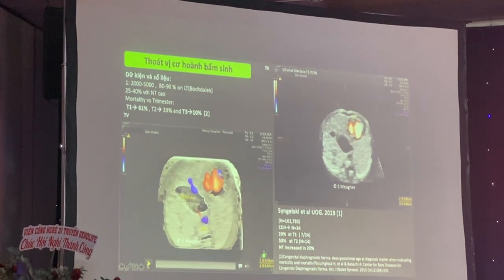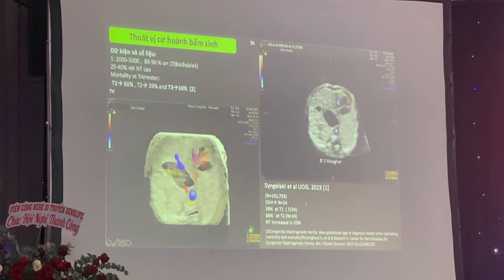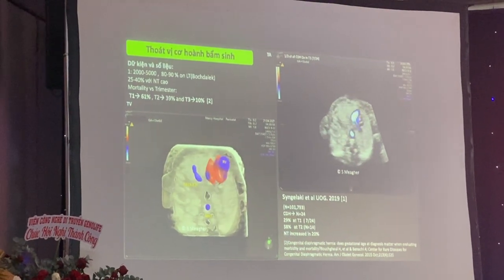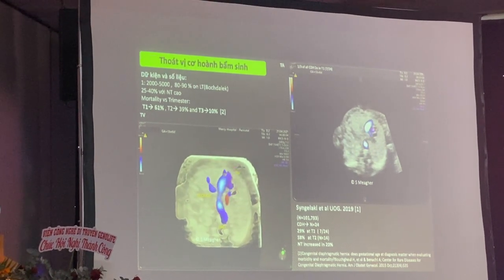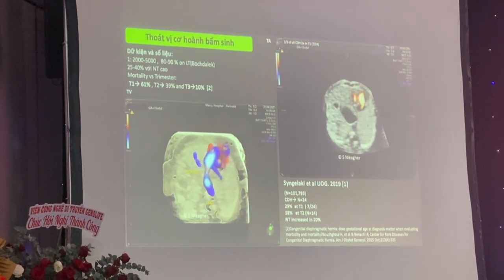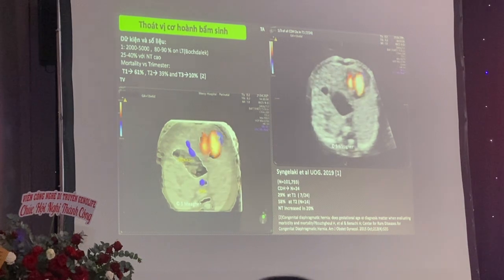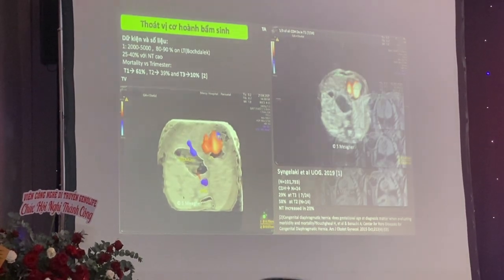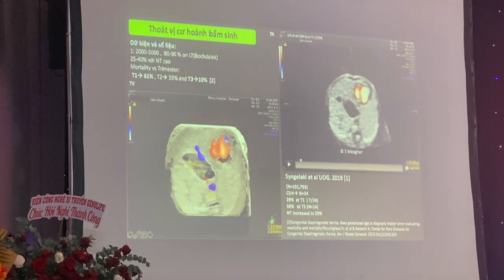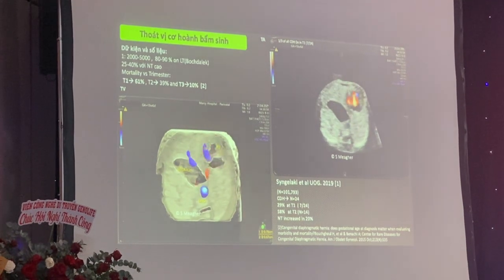Now moving to examination of the fetal chest in the first trimester, is it good? Well, it's not good for congenital pulmonary airway malformation. You cannot detect CCAM, congenital cystic adenomatoid malformation. You cannot detect pulmonary sequestration, but you can detect diaphragmatic hernia. And in this case, you appreciate, if we look at the heart, it is up in the chest, in the right hemithorax, and the stomach is up here within the fetal chest.